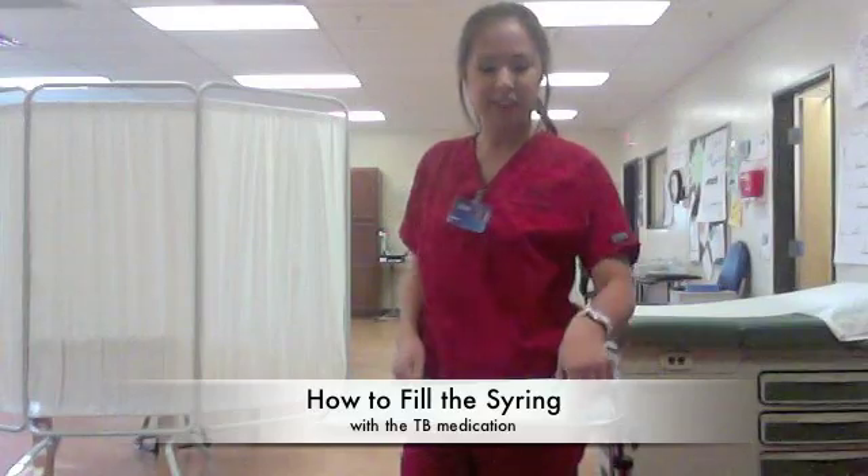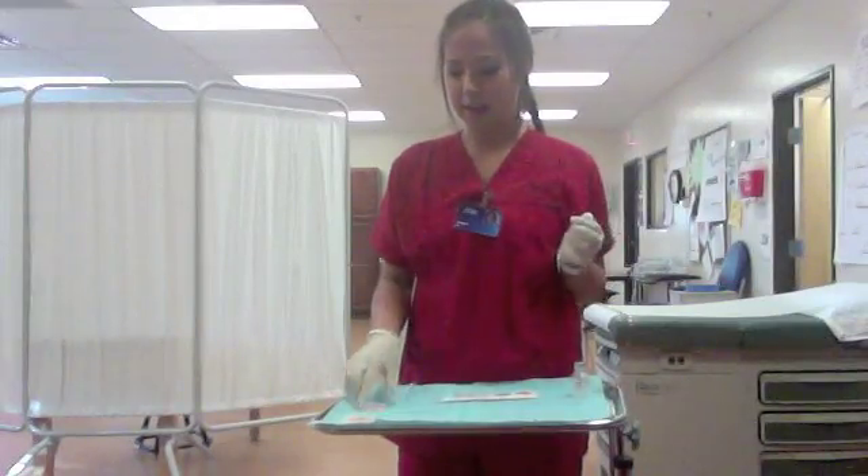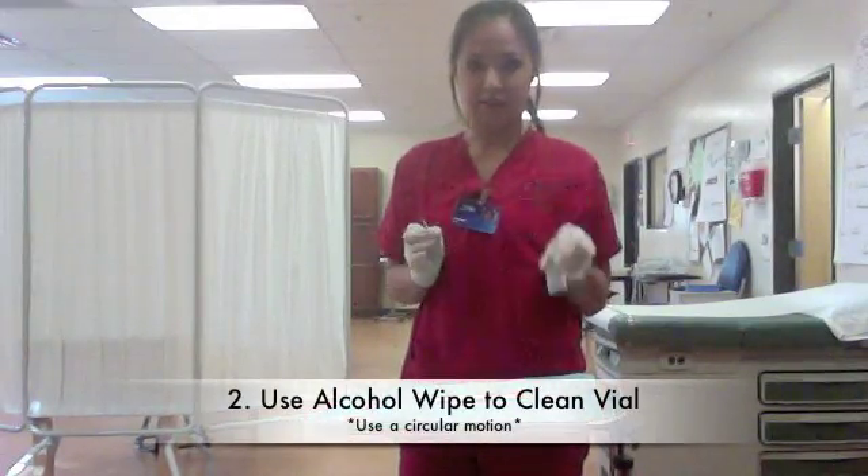On a TB test, the first thing you need to do is to put on your gloves. The next thing you'll have to do is wipe your vial with an alcohol wipe.